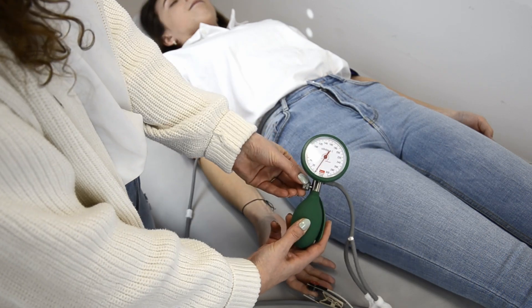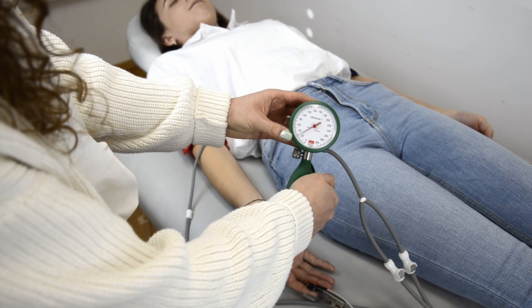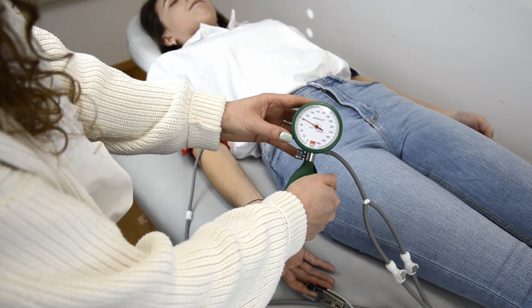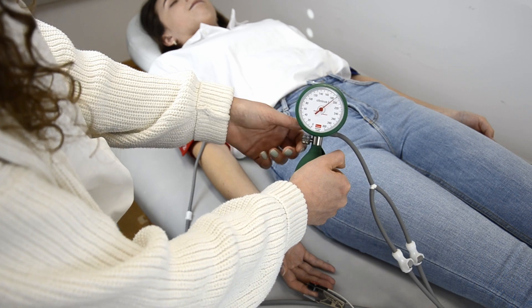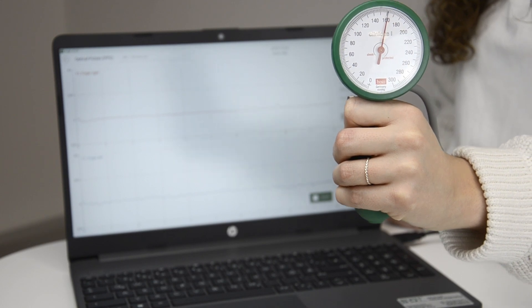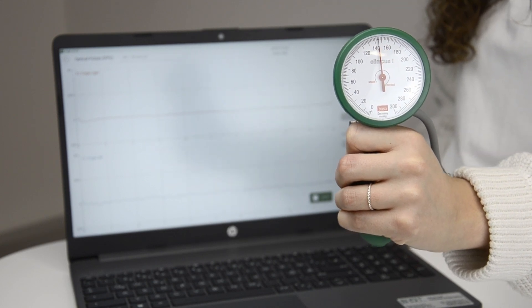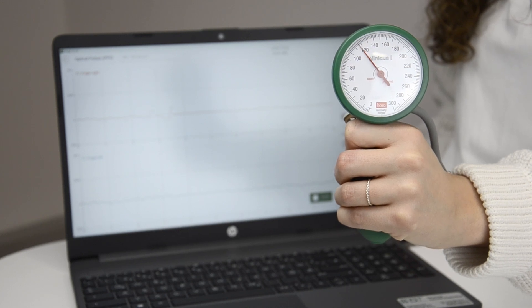Apply pressure in the cuffs using the hand pump. Increase the cuff pressure until the pulse waves disappear and the flat line is displayed. Release the cuff pressure slowly. Observe the manometer and note the pressure at which the first pulse waves reappear.